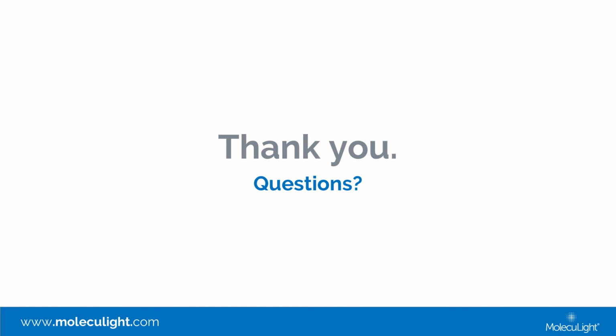Sure. What we're doing right now, because this is a new procedure with Category 3 codes, and at least we have the recognition from CMS for assignment to a paying APC, we're considering this an education phase. So right now, we know that there's nothing that would prohibit that kind of scenario given the current regulations, because we are working with new codes. For some particular hospitals and their physicians and their associated home health organizations, we've worked out with communication at their regional level with their MACs what would be an appropriate scenario. So right now we do have some cases where the physician is observing the image that has been taken by a healthcare worker assigned and credentialed to do this procedure in a home healthcare setting. And we're in the early phases of that billing and working with the payers. As I say, it's really right now an education phase.